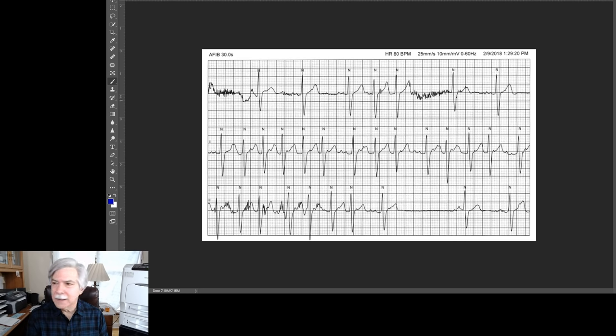And it shows somewhat of a sinus bradycardia on this side of the tracing with rates in the 50s, and then speeds up and slows down. And then you have what looks like a rapid run, irregular, in the range of about 100 beats a minute or so. And then look, when that breaks, you've got this long pause before the first sinus beat kicks in right here.